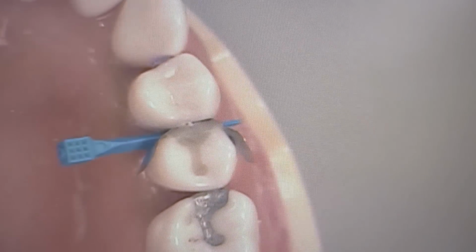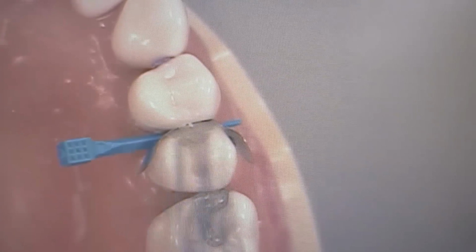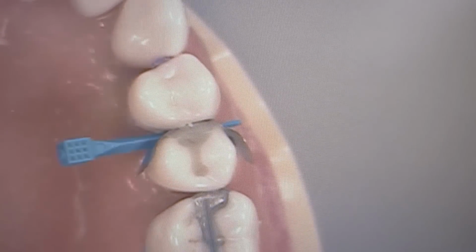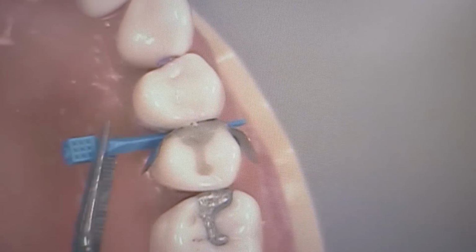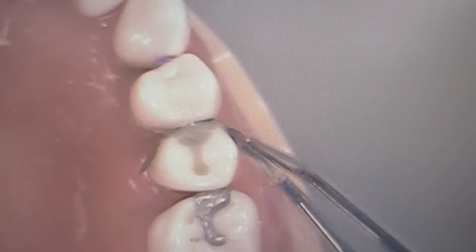It meets resistance and it's only used to adapt the bottom of the matrix. So the wedge is only used to adapt the matrix. Just by looking at the restoration, it's going to be over contoured. Since it was over wedged prior, the restoration might be over contoured in this instance.